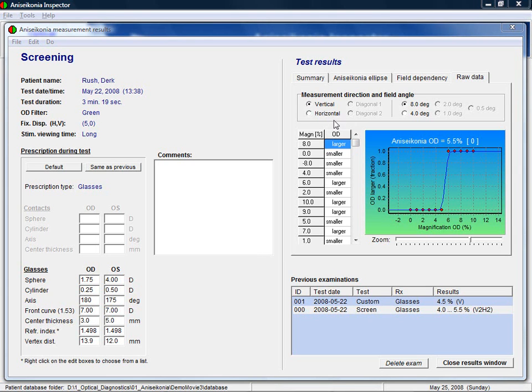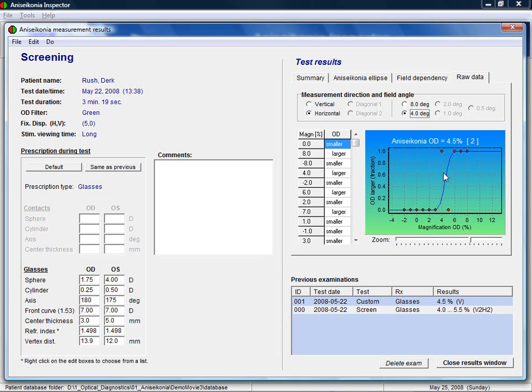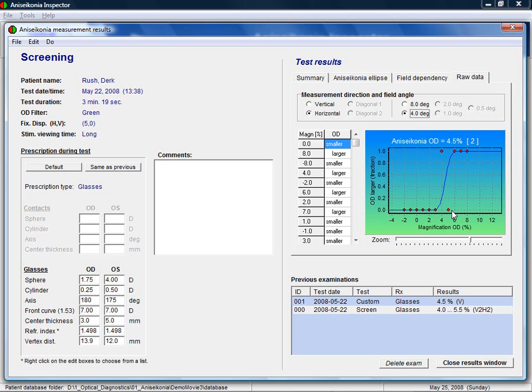If we look at the horizontal direction, at 4 degrees field angle, then we see two inconsistencies. This means that around the calculated amount of aniseikonia, there were two measurement points that were inconsistent with the rest of the data. A few inconsistencies does not necessarily mean there is a clinically significant measurement error. But with three or more inconsistencies, you are advised to look at the raw data to see what happened.